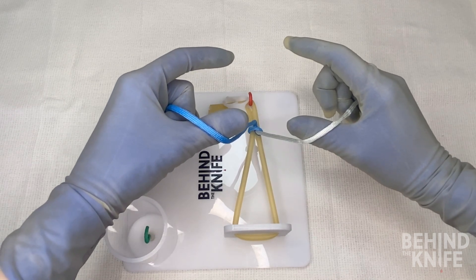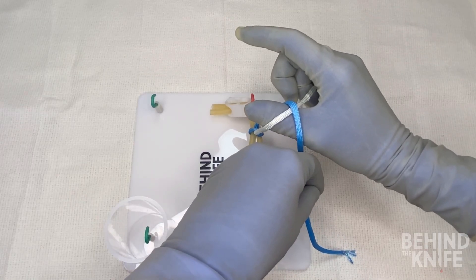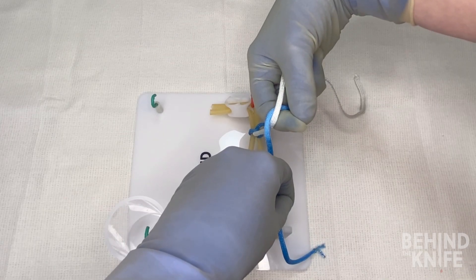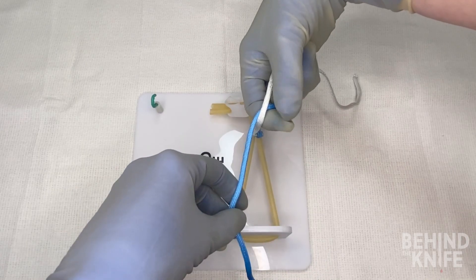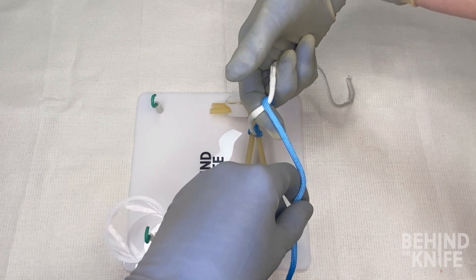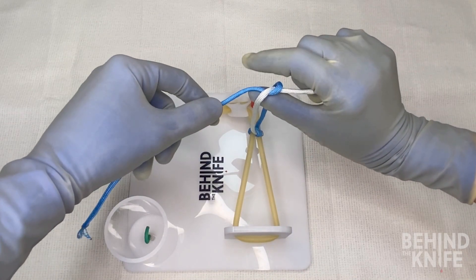If we're throwing right-handed ties, we'll take our left hand and cross it over the string that's on our right thumb to make an X — very similar to what we did before. We'll pinch our thumb and index finger together and once again rotate them through the knot, so now our thumb is on top and our index finger is on the bottom. We'll unpinch our index finger and our thumb, and using our left hand we'll take the blue string and drape it over our index finger. We'll once again pinch our index finger and thumb with the blue string in between them and rotate our hands back through, bringing the blue end of the string with us.